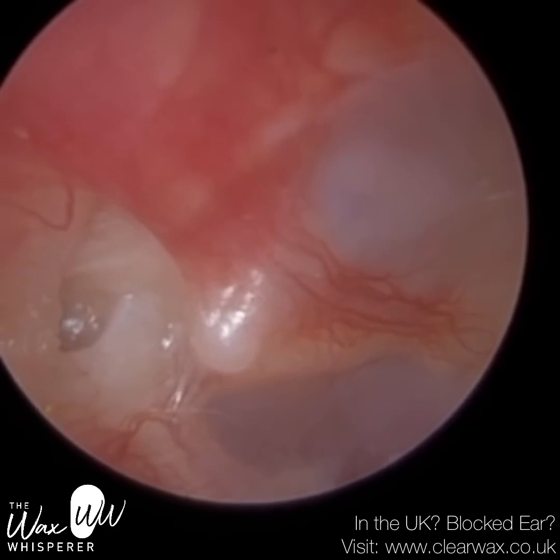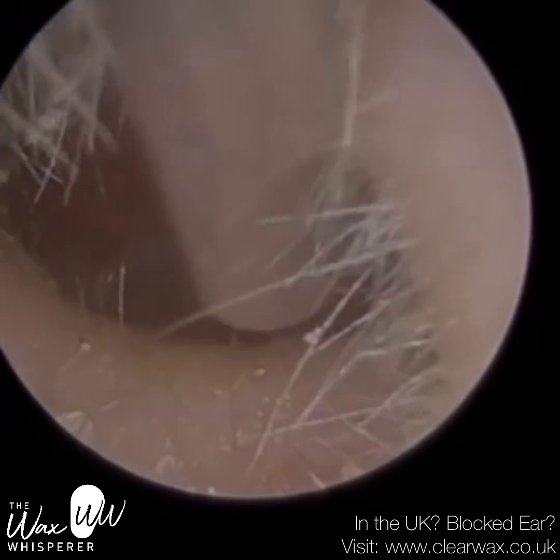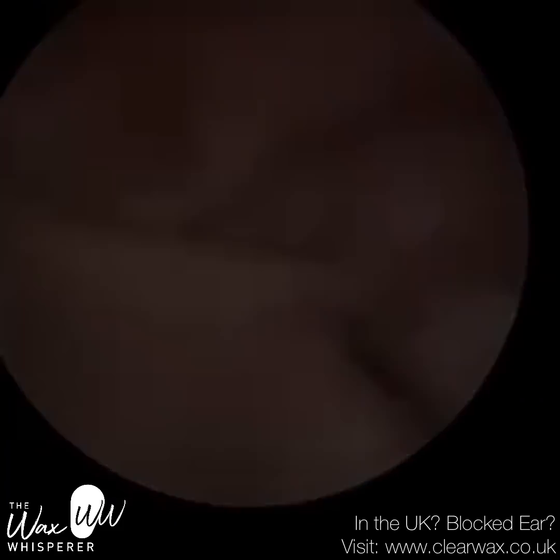So this is the patient's left eardrum. You can see on the left-hand side that's an attic retraction — the eardrum's sucked in. They've got a bit of eustachian tube dysfunction, but the attic's clear. There's no buildup of dead skin or cholesteatoma.